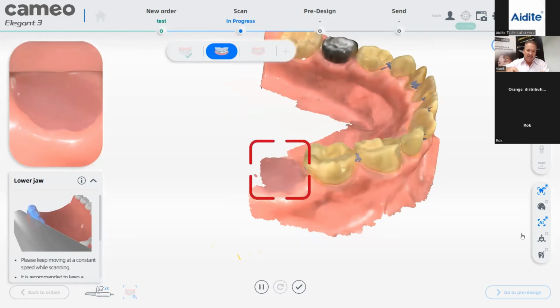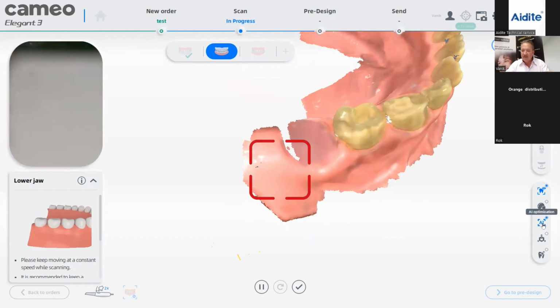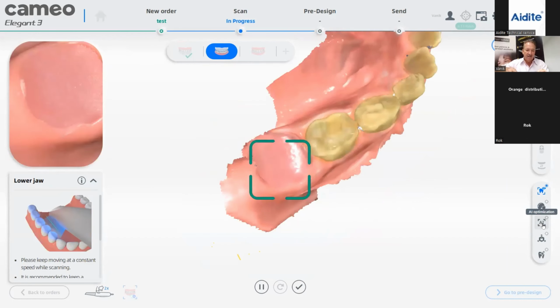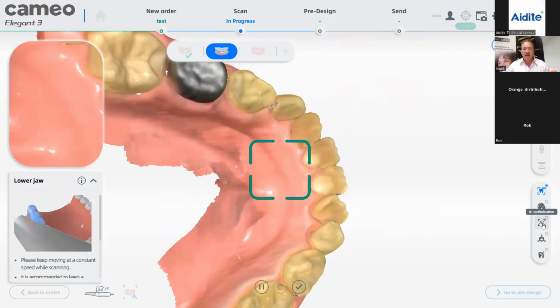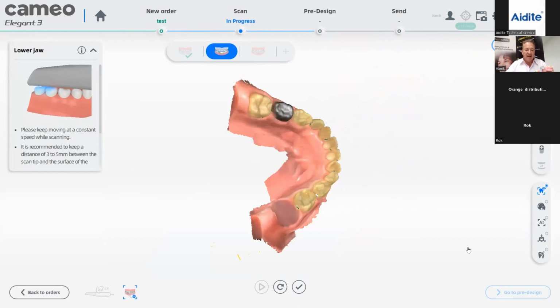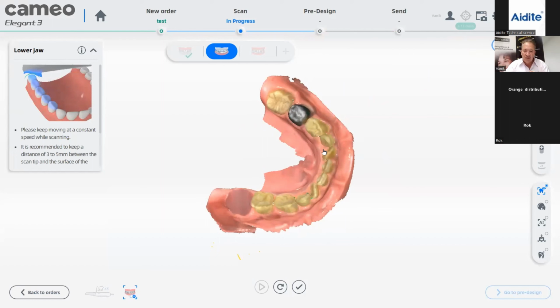And you see here now, it's not scanning so nicely here. Then I just switch off the artificial intelligence. Okay, get this switched off. And now you'll see how easy it scans this area. So if you have any problem sometimes that it's maybe not scanning, just switch off the artificial intelligence. If you have a problem, let's say when you scan and you want to rescan, always look for an area which is very nice and which you see very strong.